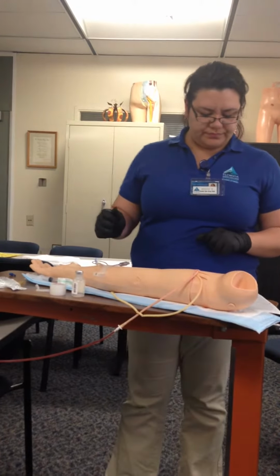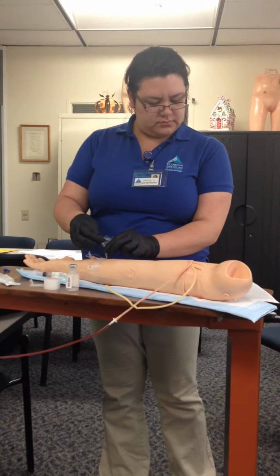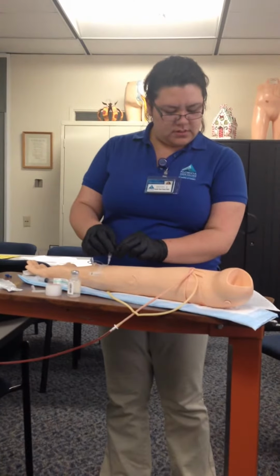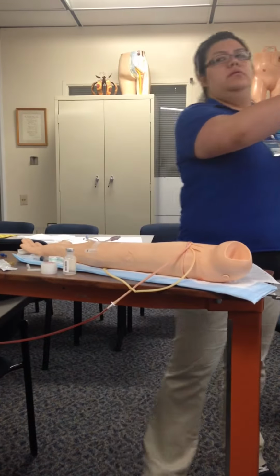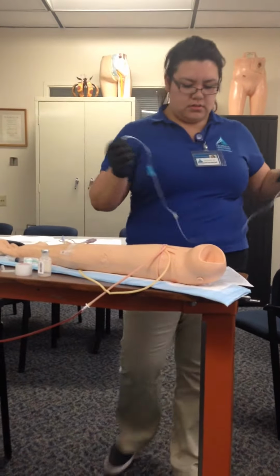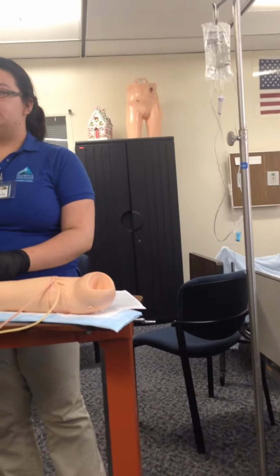So I'm going to clean the port with alcohol. I'm going to clean my port with alcohol and then insert the needleless device.